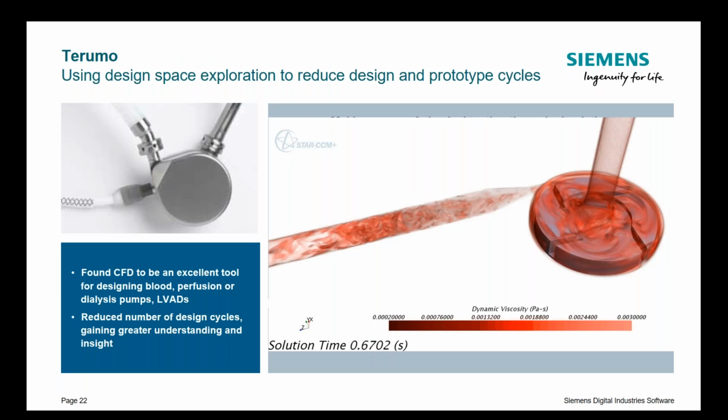So in this case, we can look at a design which needs to be optimized in the case of the cavitation threshold of this pump and the maximum allowable shear rates. What we need is to understand that a longer lasting cavitation event in the pump can cause damage both to the pump and to the blood. And so sealing problems in rotary pumps can lead to heat generation and thrombus formation.